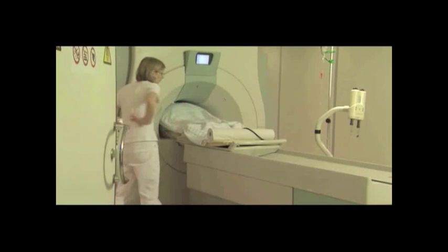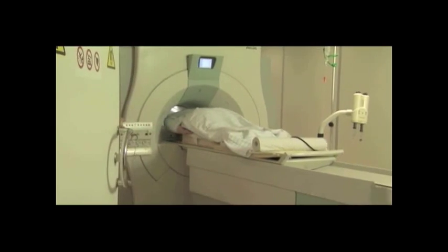Once the target has been verified, shuttle the patient out of the magnet bore and proceed with the biopsy.